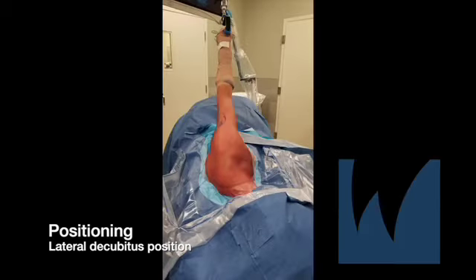The patient is placed in the lateral decubitus position with a beanbag holder and rotated approximately 30 degrees to align the articular surface of the glenoid parallel to the floor. The left arm is abducted to 60 degrees and held in balanced suspension.